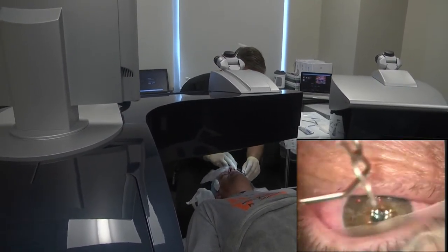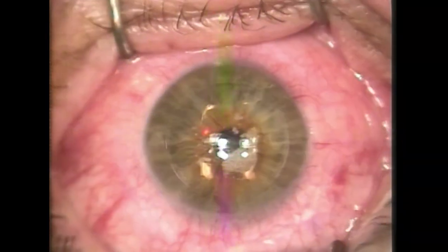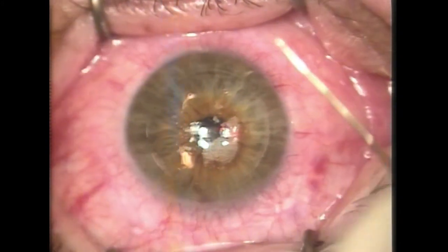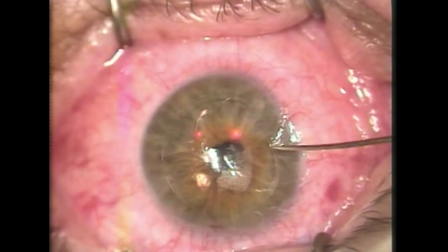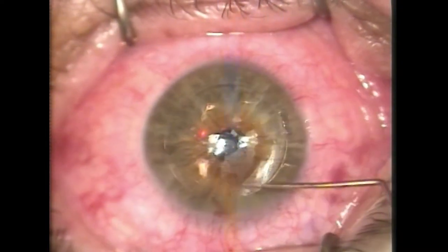And here again is the little eyelid holder. You just keep relaxing. All the data is entered into the laser computer just perfectly — we're double, triple checkers, and it's just perfect. So you just look right at the green light, and don't worry that it's going to move around a little bit, that's normal.